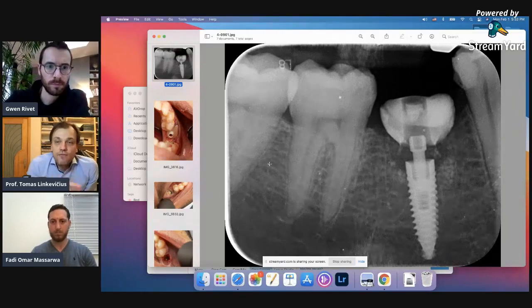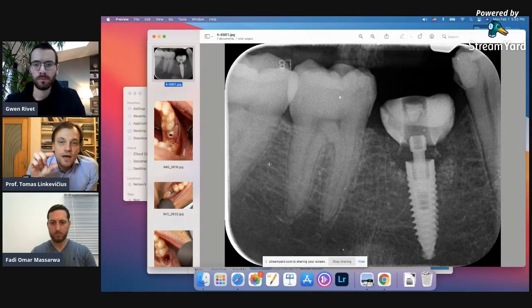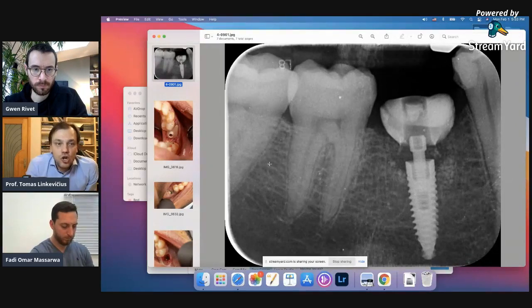But what I think is the most important rule is that when our connection goes deeper in the bone, the more stability of the connection is important. And like internal hex is actually a 45 degrees connection. And a 45-degree connection is not stable enough in that kind of position below the bone.